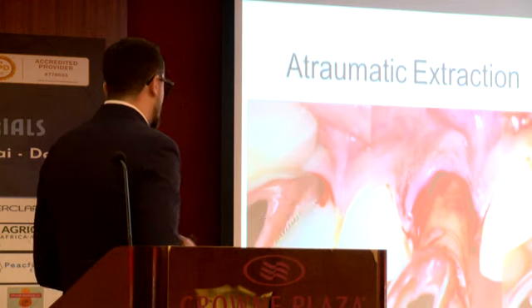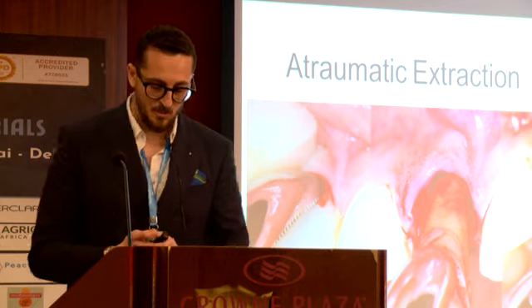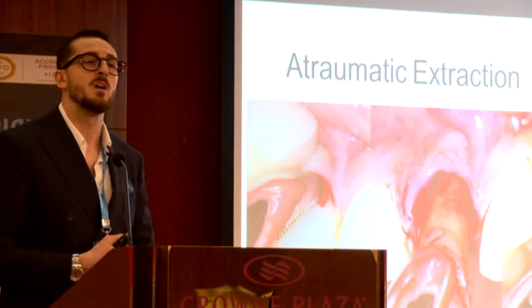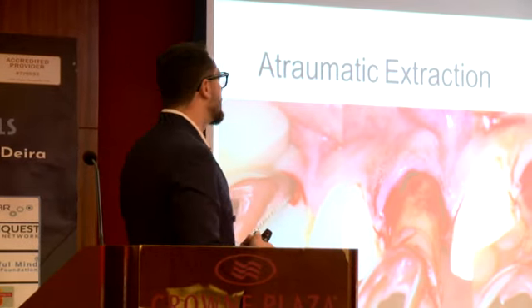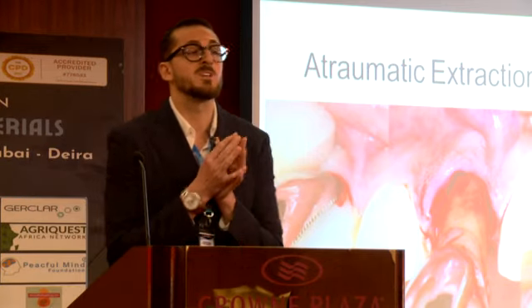So we chose to go with the trimodal approach. What does the trimodal approach mean? It means that we are going to place an immediate implant after the extraction, with a flapless approach, and have an immediate restoration the same day of the surgery. So the first step, and it's the crucial one, is that we have to take out the tooth.